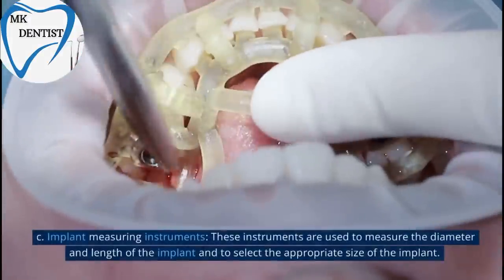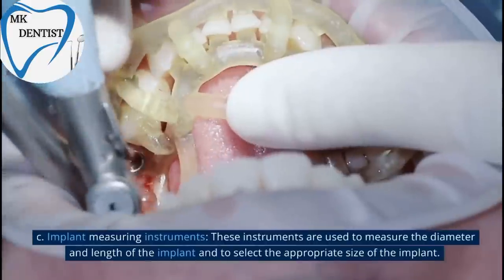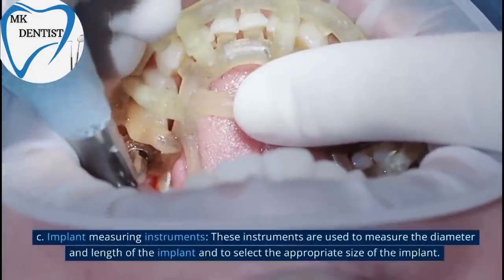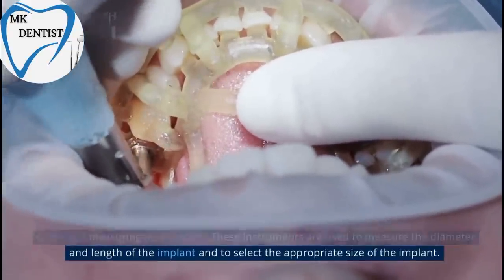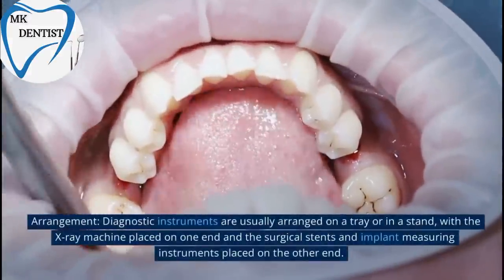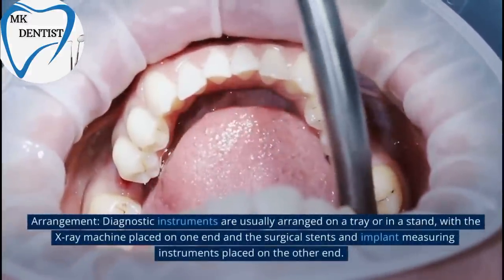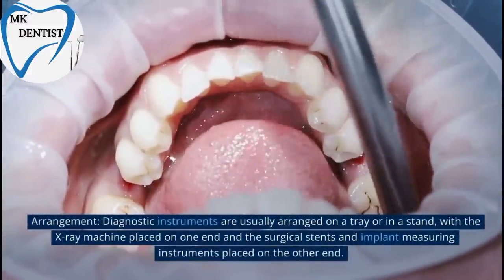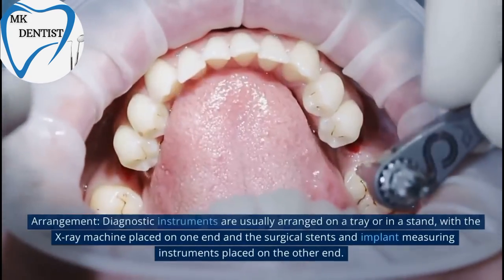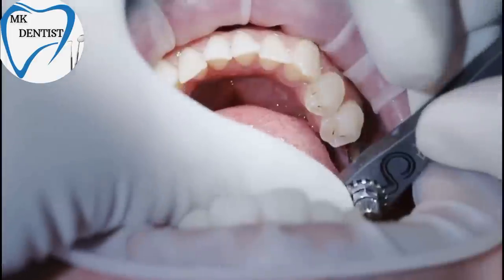C. Implant Measuring Instruments. These instruments are used to measure the diameter and length of the implant and to select the appropriate size of the implant. Arrangement. Diagnostic instruments are usually arranged on a tray or in a stand, with the X-ray machine placed on one end and the surgical stents and implant measuring instruments placed on the other end.